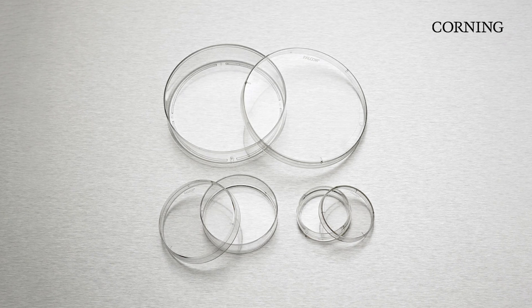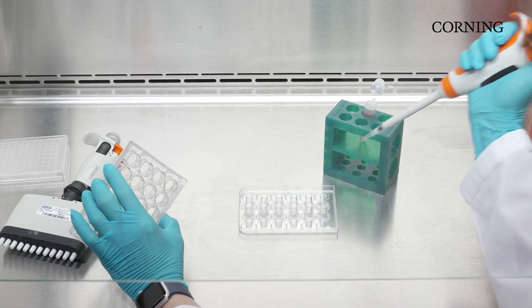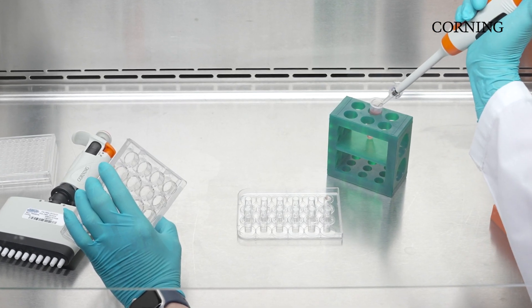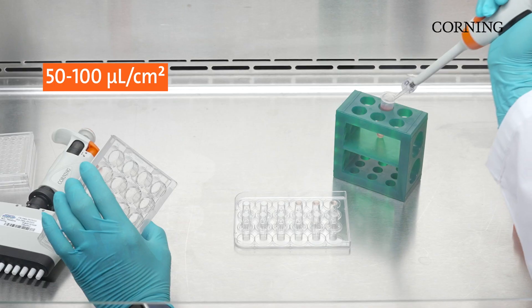Corning Matrigel Matrix was traditionally used for two-dimensional cell culture to aid in cell attachment and to maintain stem cells in their undifferentiated state. The appropriate volume for coating for this kind of application is generally around 50 to 100 microliters per centimeter squared of a diluted Matrigel Matrix solution.